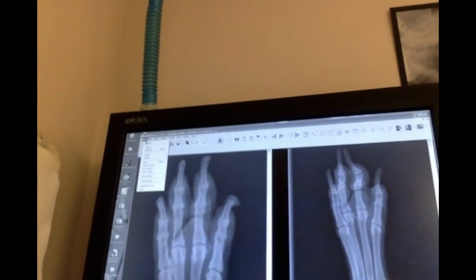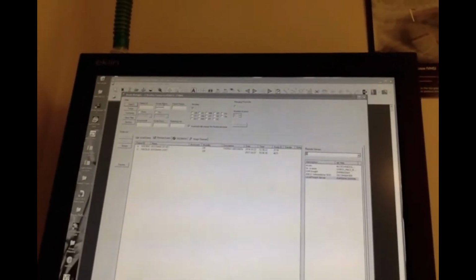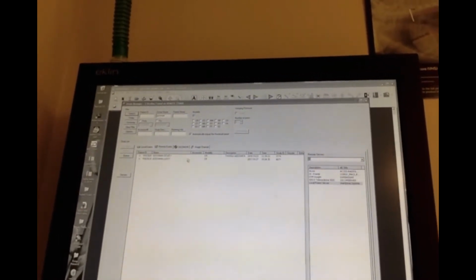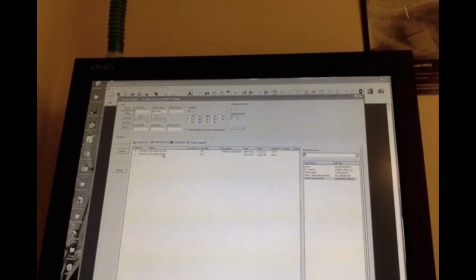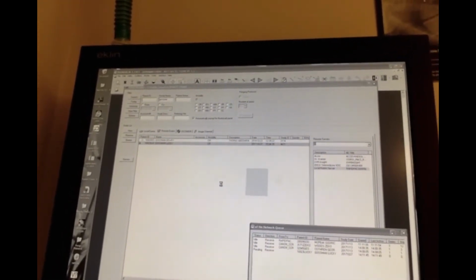So we go up to File, and I'm going to hit Search, and then I can search for him based on his patient ID, his last name, or his first name. So I'll search him by his last name, Gossman, and then we can search by the date too, so I want to deselect that he's got them taken today, and I'll just search for how many of them. So there are 2 Gossmans in here, and this is Mr. Lucky. So I'm going to go ahead and click on him. It says close the current window, yes. And then it'll find his x-rays.